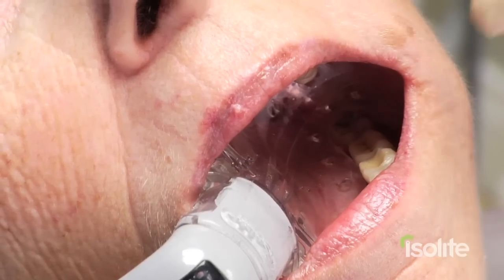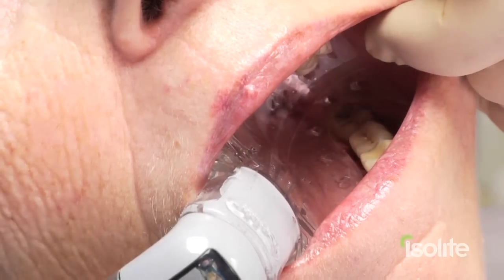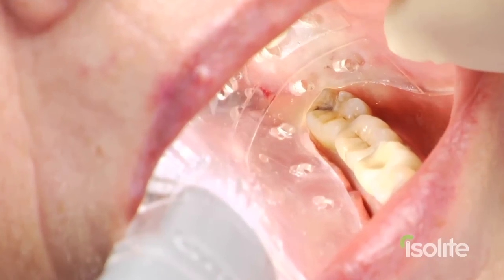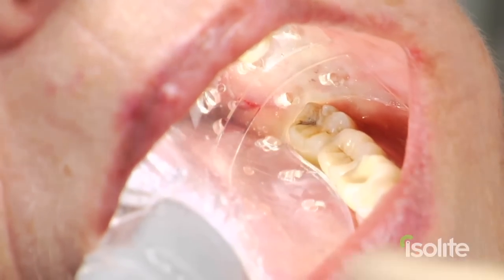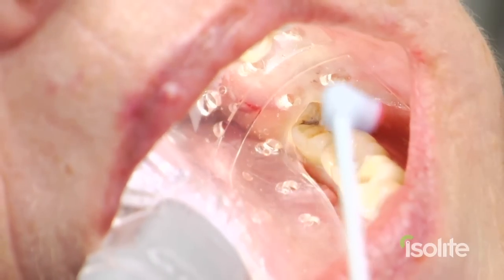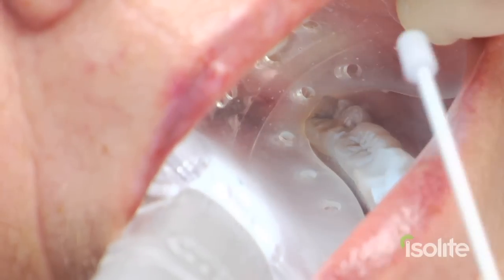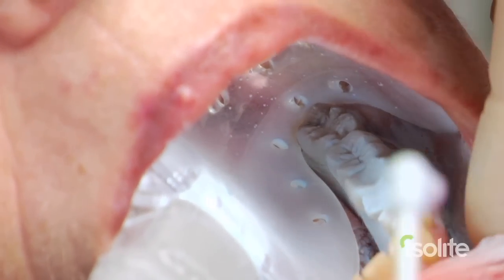First thing they're going to do is do the imaging for correlation of a CEREC procedure. We draw off the teeth. As you notice, the tongue is kept out of the way, the cheek is kept out of the way, and as I turn on the vacuum and we apply the CEREC Optispray — no vacuum there yet — you can see that most of the spray is kept within the mouth very, very nicely.